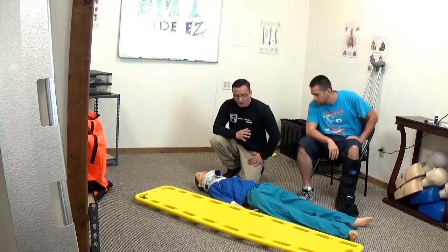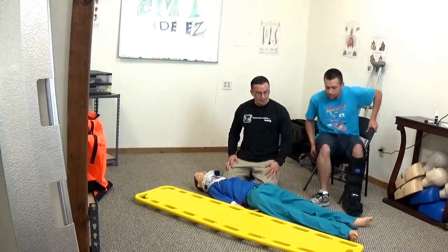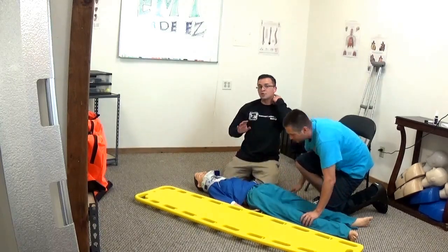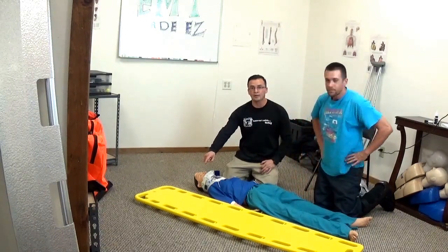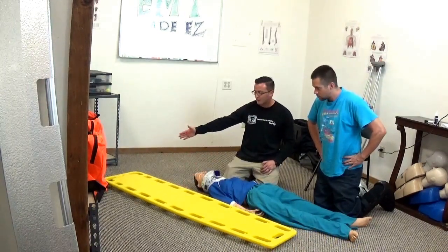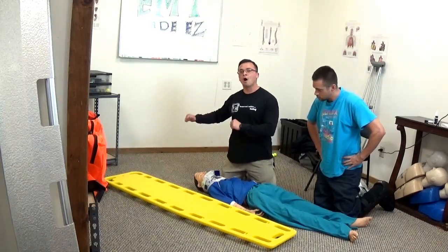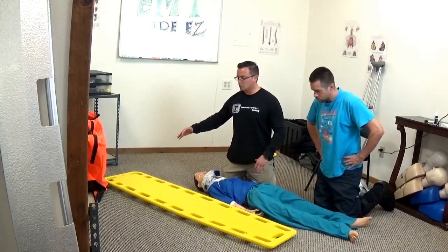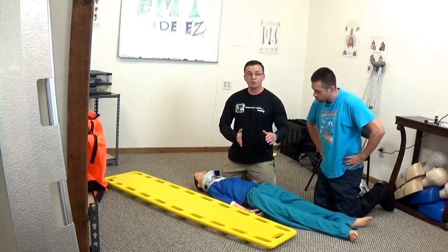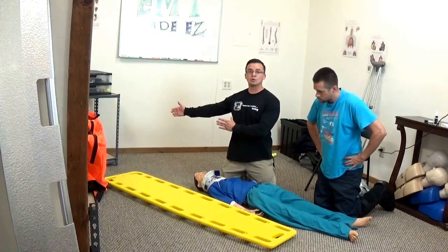After that, have your second partner kneel next to you. Before positioning them, you have to place the board appropriately. The best way is to place it next to your patient about 12 inches above the head. This eliminates the need to constantly reposition the patient up and down the board. If you do it right, you'll only have to move the patient once or twice. That's the whole point behind placing the board at least 12 inches above the head.